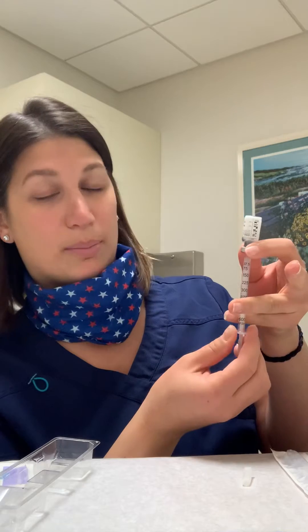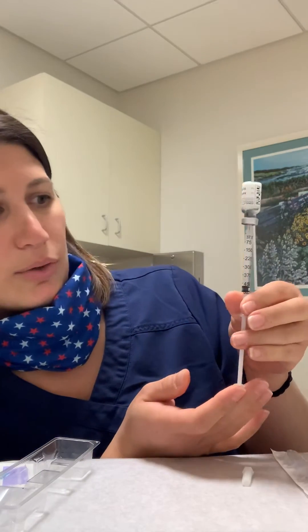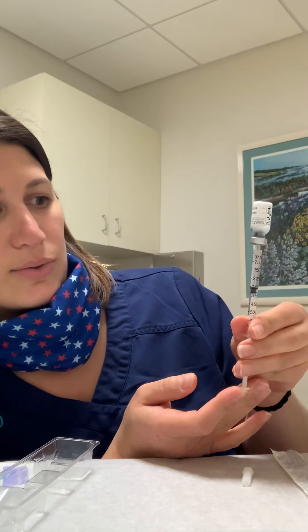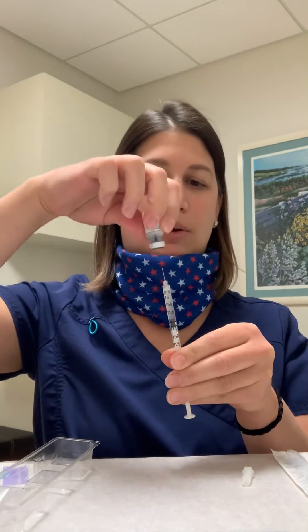Initially, this will fill with micro bubbles and air, so you'll just let it fill. Then whatever your dose is — if you're at 300 — you're going to push up to that longer line associated with the 300, and then you're going to pull this vial off.